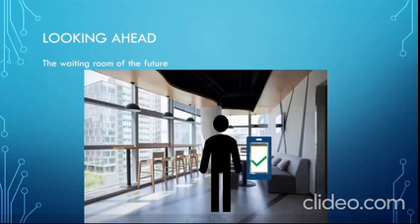The processing for the vast majority of commercial AI applications that are available today is in the range of seconds to a couple of minutes. So in a short time after the acquisition of their exam, a patient could receive a text alert in the waiting room saying that their study has been cleared for emergent incidental findings and that the full radiologist report would be completed later. The patient would then be cleared to safely return home. This service could be an impactful addition to patient safety and could help to give patients additional peace of mind when presenting to imaging centers for their exams.